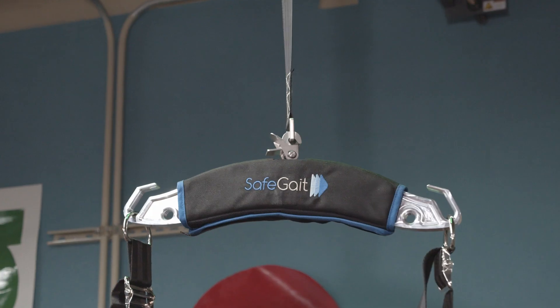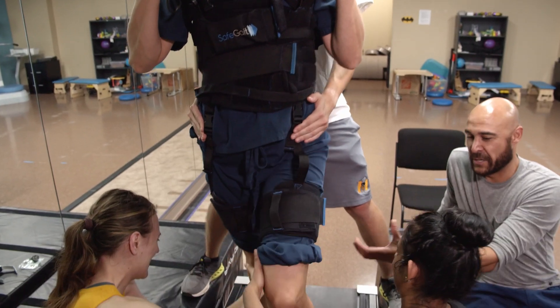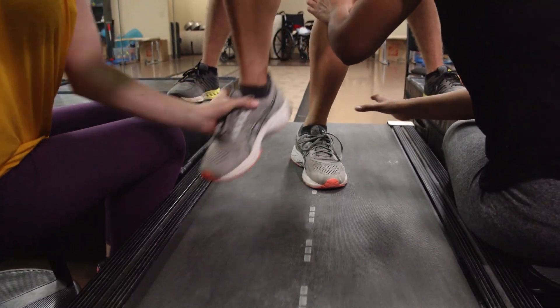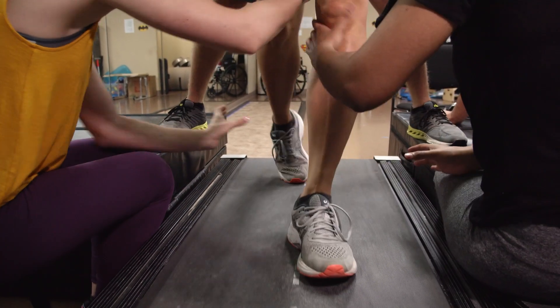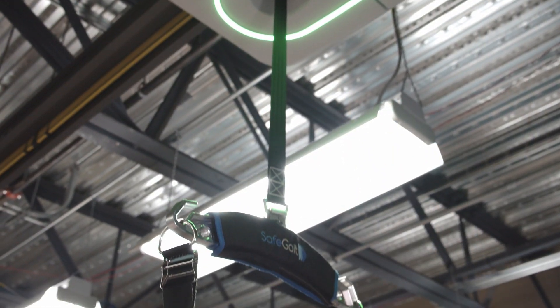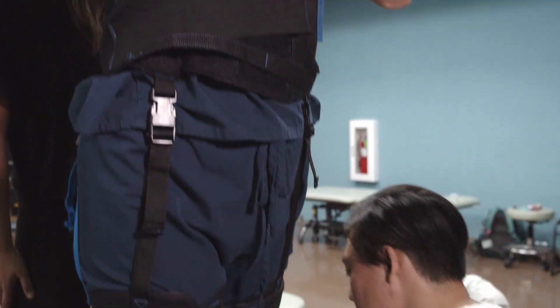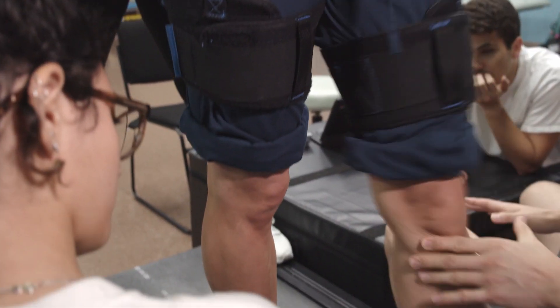We don't really fully understand how important walking is until you lose it. The purpose behind this machine is to re-teach the patient how to properly walk so they can continue their lives, their families, their jobs. What we have to do is make them feel safe and comfortable. With this machine, since we have them rigged up where they can't fall, they can have that sense of security without holding back. It's a good reinforcer and safety net for that patient.